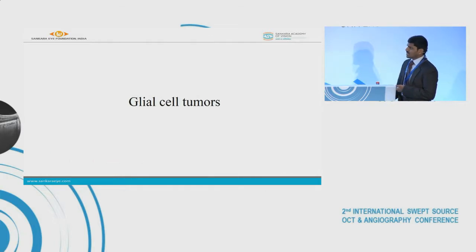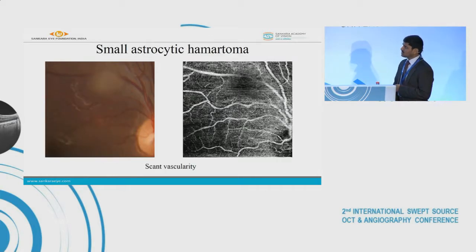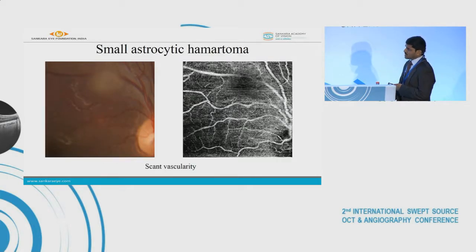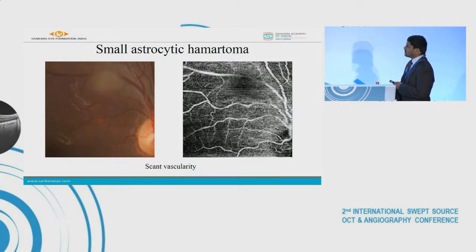Coming to the glial cell tumors — this is a 13-year-old with a known case of tuberous sclerosis and a small astrocytic hamartoma. On OCTA we can see that there is hardly any vasculature, probably very scant vascularity.